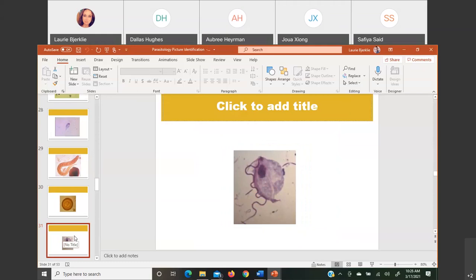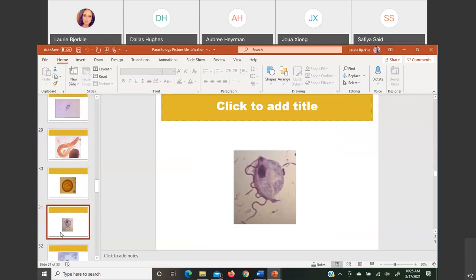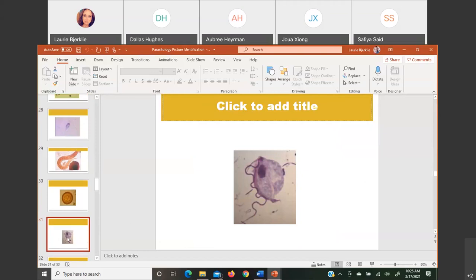There's our trich. Oh my goodness. Trichomonas. Nice undulating membrane down the side of it. That waving membrane down the side is the key on this. Otherwise, the more common way that we all look for trich is, of course, in those wet mounts, wet preps, or urine. And you can't see it up this close and stained. This is stained and really zoomed in, but yeah. You see it, and it has that darting or jerking movement quality to it. So it doesn't swim along nicely. It's like jerk, jerk, jerk, jerk, jerk. So if you guys got to see it, you'll have noticed that.